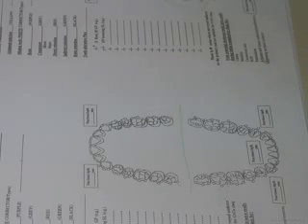Okay? It has relations. Try to imagine it in 3D. It has 6 relations. What is its relation closely to the survey line? It's below the survey line, right? It's in the undercut. Which undercut? The one suitable for the clasp. Because every clasp design or clasp material has its own, and this came up in the exam. Every clasp type has a specific measurement for it. Okay? So the first thing is its relation to the survey line occlusally. Okay, let's try to find a clasp.